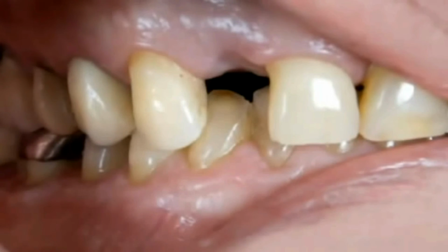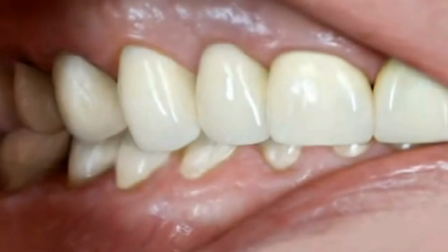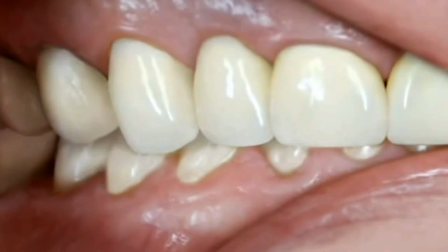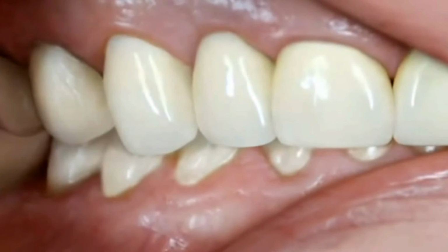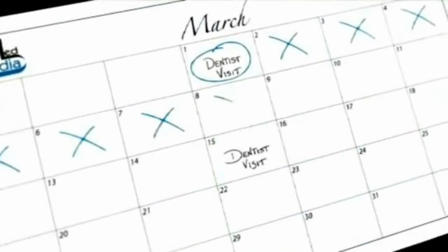A bridge is used to replace one or more missing teeth in your mouth. Bridges are fixed in that they are cemented on the supporting teeth, or in some cases, fixed on an implant that has been placed next to the missing teeth. It normally takes 2 or more visits for your dentist to complete the bridge.